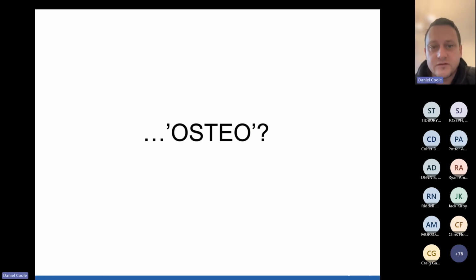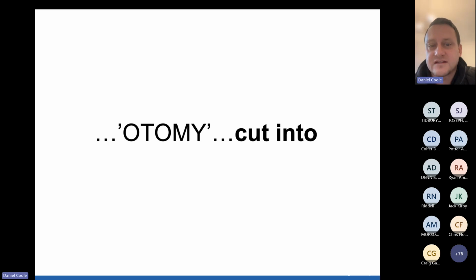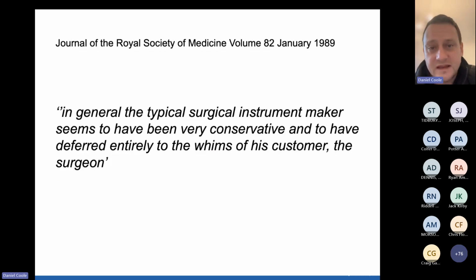So in this case, osteo, meaning bone, otomy, meaning to cut into, and ostomy means to create an opening. So to go back to reflection on the nomenclature of instruments, in this example I have here, a Capener osteotome. So obviously we're combining the words osteo and tome, using those previous terms, and that's how the instrument's getting the name. So in terms of Capener, again, reflecting back to my journal article that I've mentioned a couple of times now, and I can't actually see that.